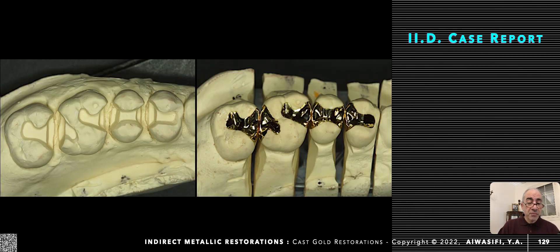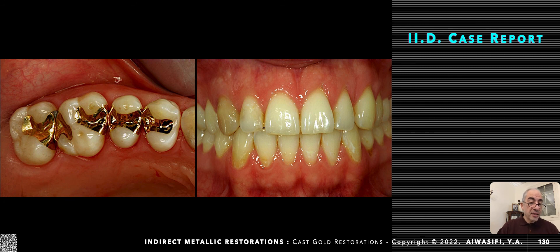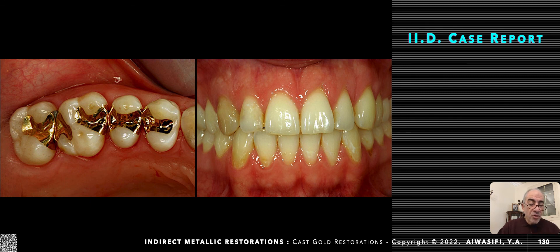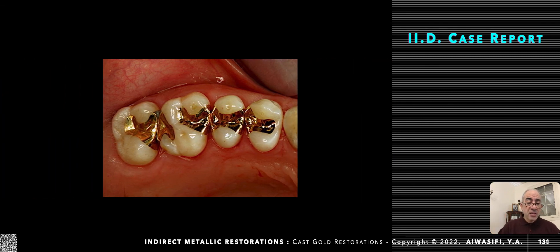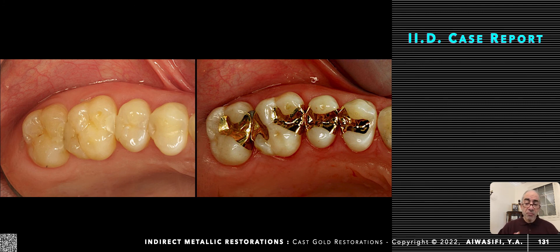You could check it on the articulator, reconstruct and reproduce your contact properly, adjust your occlusion on the articulator until you could inspect and make sure that the patient bites in centric with maximum interdigitation. These are our restorations placed on our die. Then comes our restoration cemented into place, and you could see the beauty of the reproduction of your contact, the accuracy of our lab technician to reproduce not only the anatomy but also the marginal accuracy. The patient is now biting in maximum intercuspation, eccentric relation is adjusted from the right side, from the left side also, and from the frontal view.